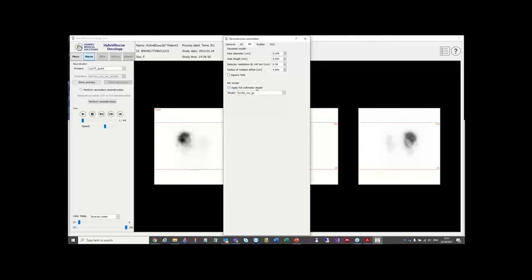We also have Monte Carlo modeling, so full collimator modeling. This model up here, the Gaussian model, is good for when you have a well-collimated, well-behaved isotope like technetium, or lutetium is pretty good as well, that we do here. But for others, so holmium, as Jill was talking about, I-123, I-131, and yttrium-90, it is not so good. You've got lots of septal penetration, scatter in the collimator septa, absorption into the collimator septa, and then emission of a K-edge X-ray from the collimator, which is then detected. So these Monte Carlo models are the simulated point spread functions, including all of those effects.